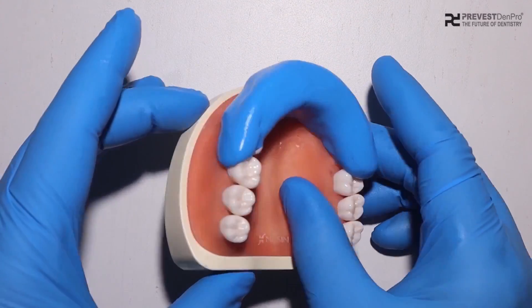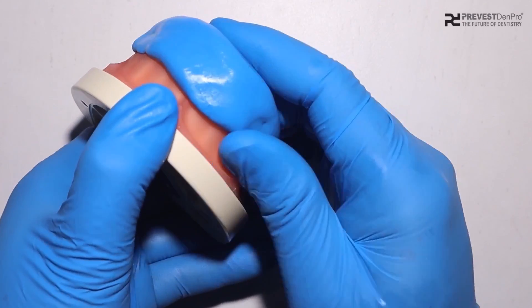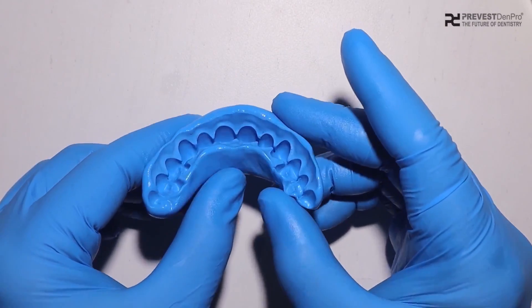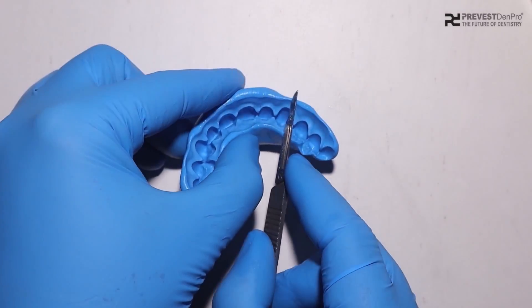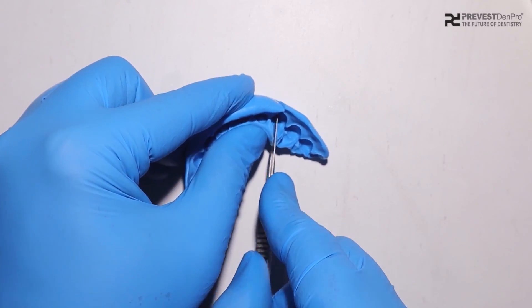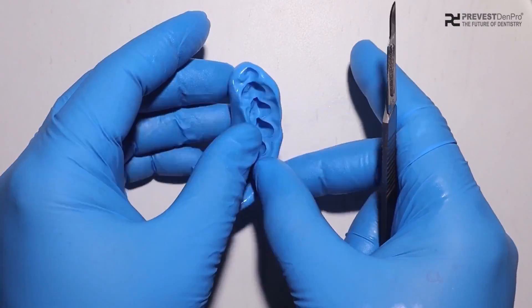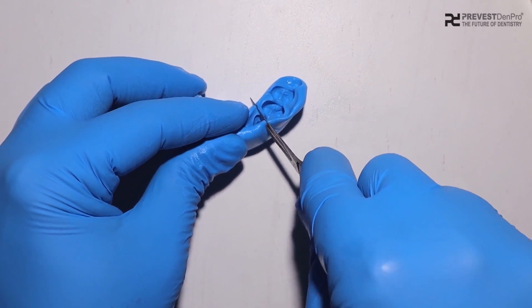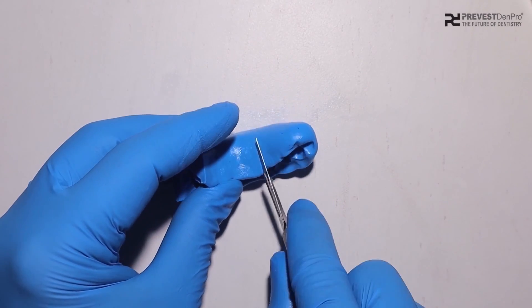After a setting time of 4 to 5 minutes, we can now remove the impression made by the Equisel Putty. We can see that the impression is very fine with all the details recorded. We can now clearly fabricate the putty index with the desired teeth that are required. Mostly 3 to 6 teeth are sufficient for the fabrication of the putty index.